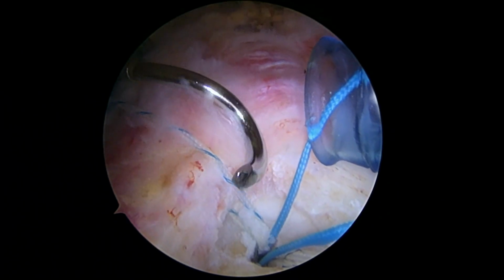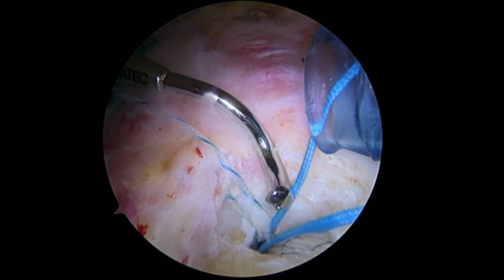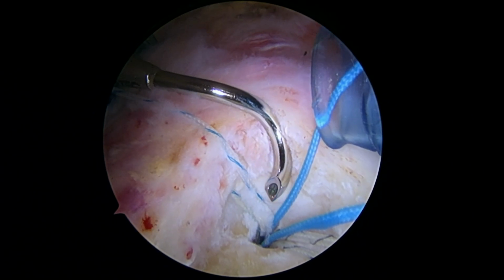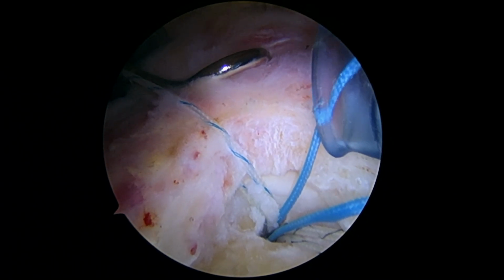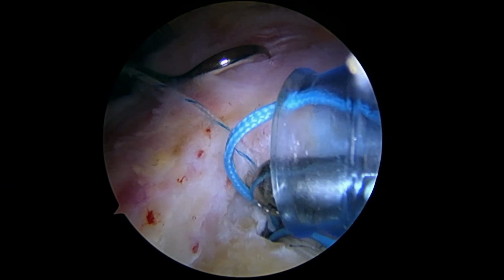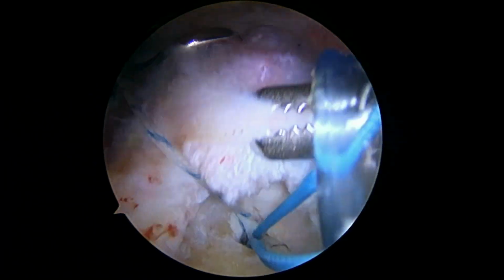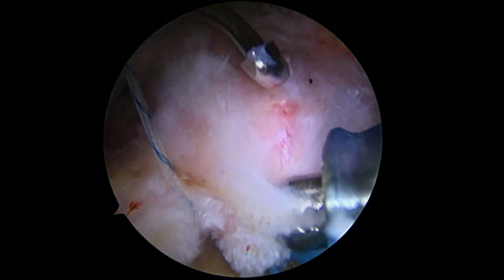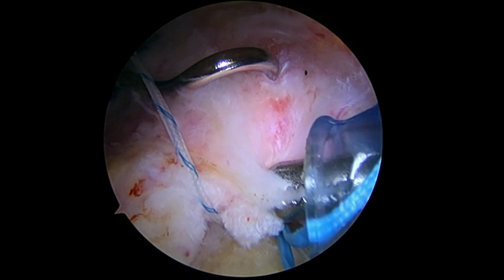And now see how this one has a little bit of a different curve. It's loaded with the same black wire. And we rehearse the stitch by placing the tip right where we'd like it to come out. That would be a great shot. So if I just backtrack, that means I want to go in right about here. But before I do that, I want to use my grasper to make sure I'm doing that while the tendon's reduced, because I want this to hold the tendon like that. So now we'll do it again. So if I want the tendon to sit like that without too much tension, that means we need to go in right about here.